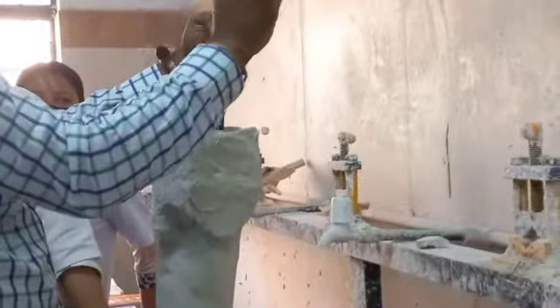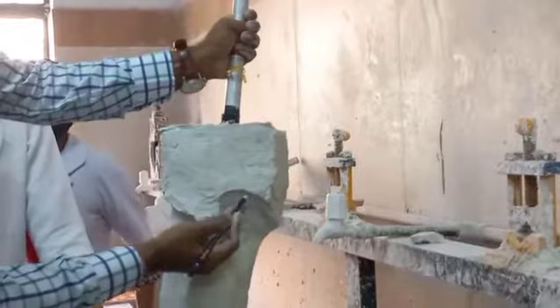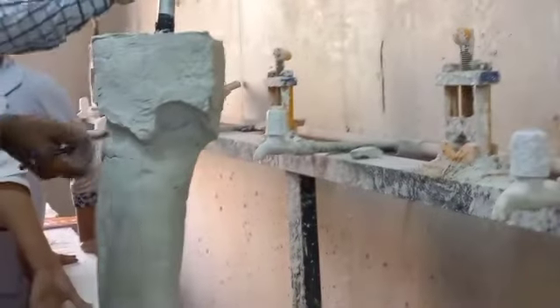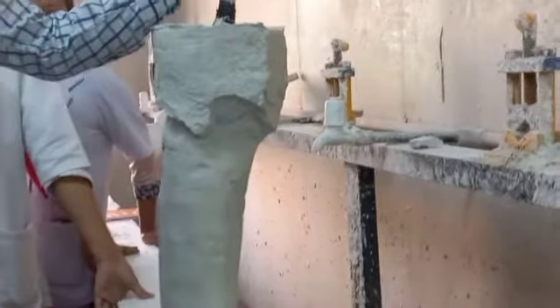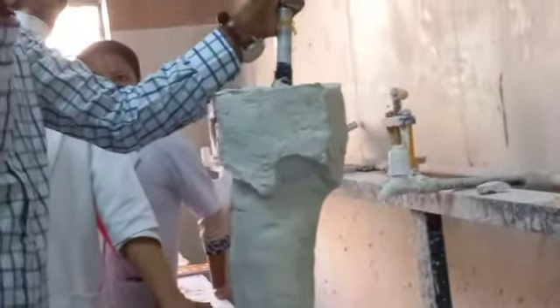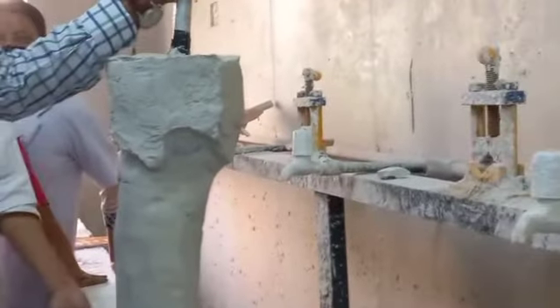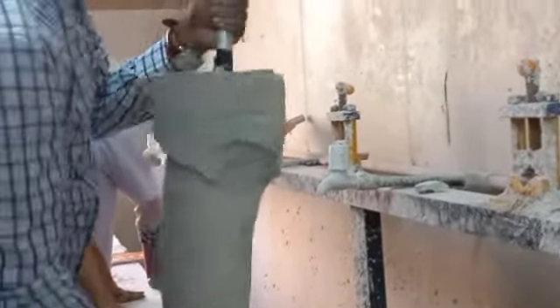Okay. So going anterior and distal, cover as much as you can and then go down. So cover, go down, and how much you go down depends upon your understanding of how much will be enough. Normally we just add about 5 mm, it may be enough, or maybe it can go down half an inch, so as to reduce any chance of loading on the lowest point.